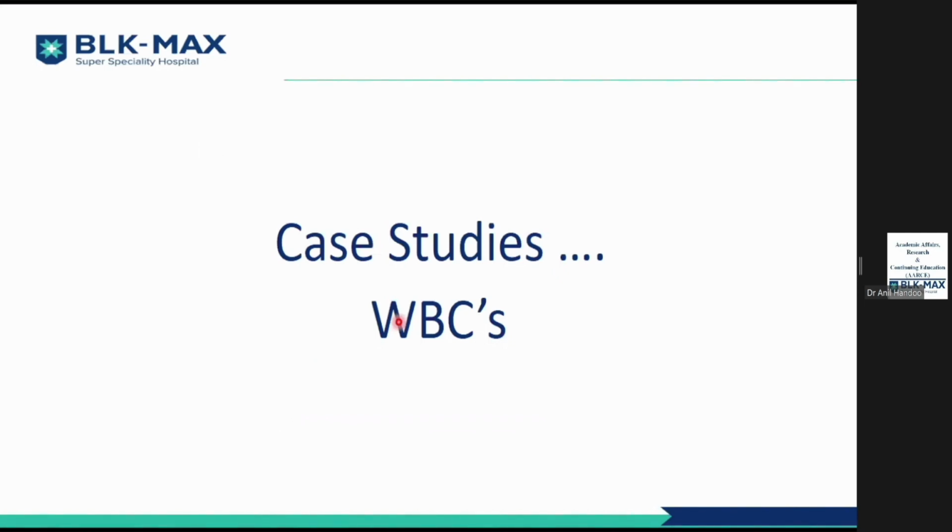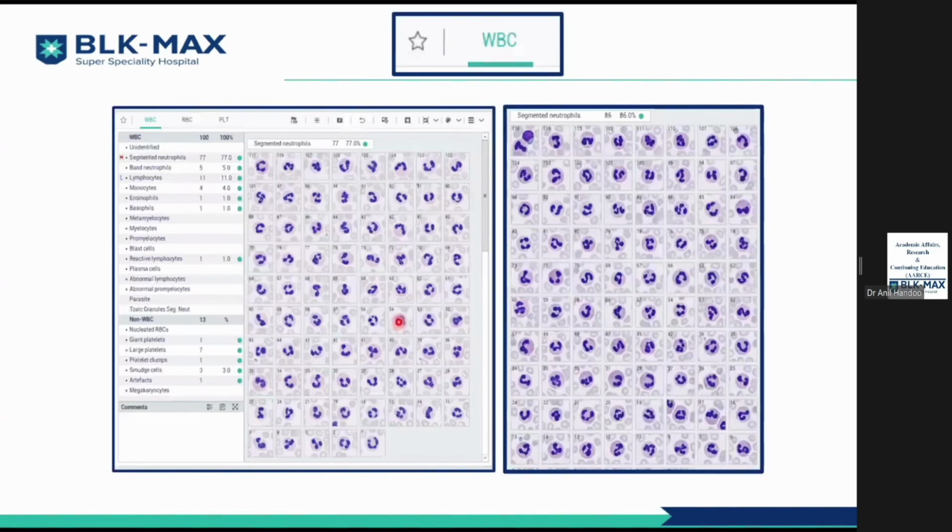I'll switch gears a little bit and take you through a few cases of WBCs wherein our digital morphology analyzer played a very beautiful role. As I showed you previously as well, this is the facade, or the page, of the WBC, which you get in front of you when you go through the lab expert software of this instrument. And you are able to pick up your segmented neutrophils.